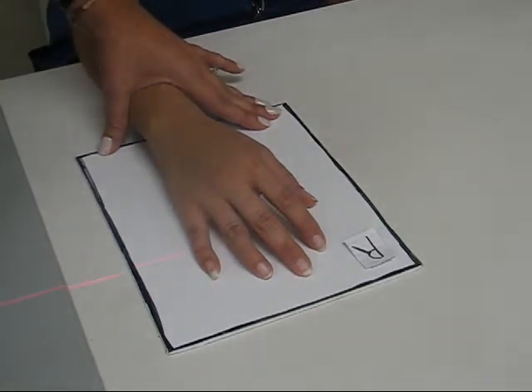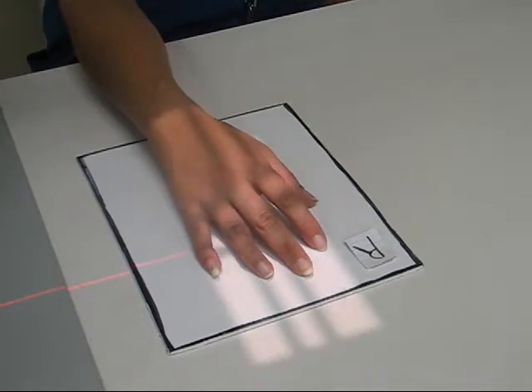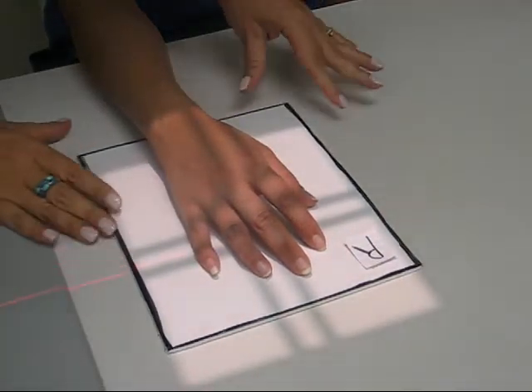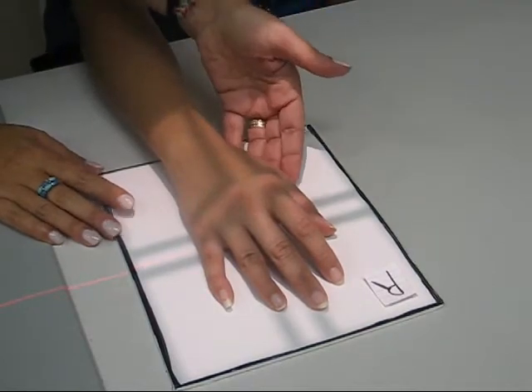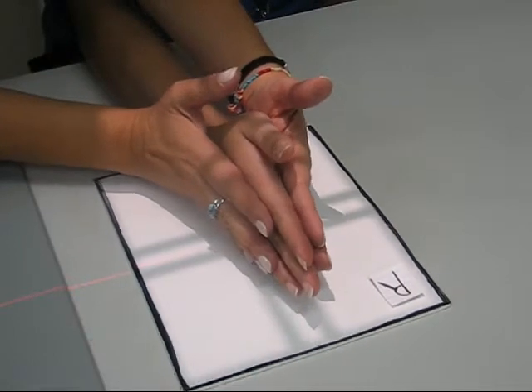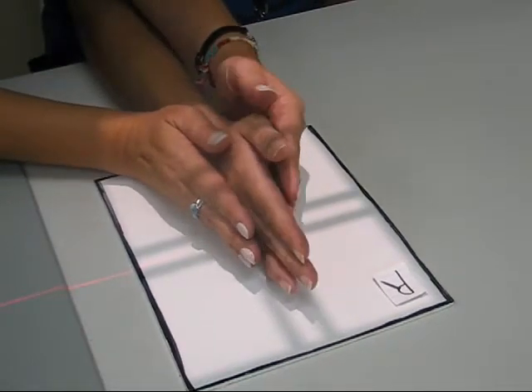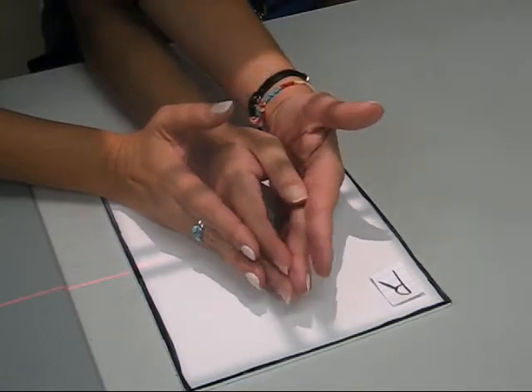Your lateral projection would be your next one. If you're doing the entire hand, there are two ways to do a lateral projection. You can put the hand completely on the lateral side and bring your thumb straight down.